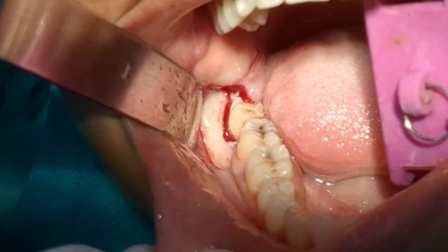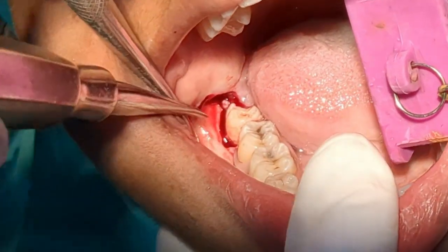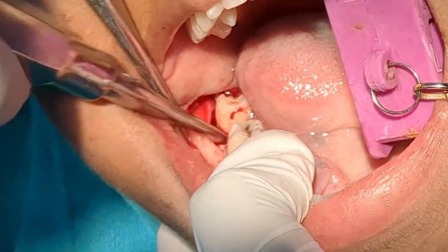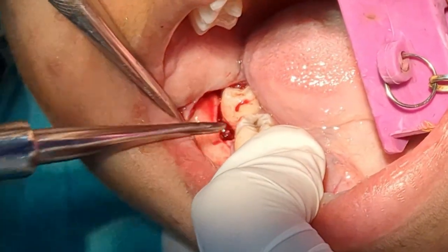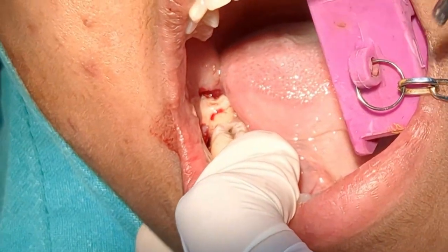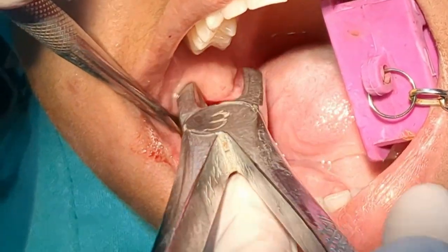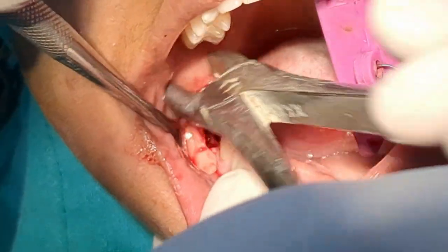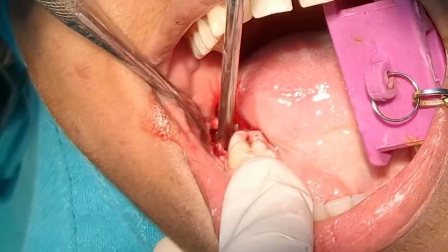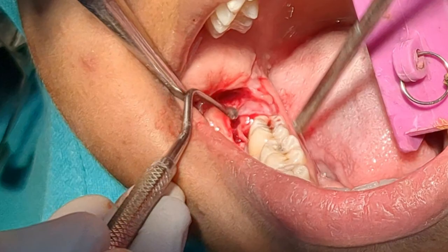This is how the bone gutter looks like. I then place a Coupland elevator in the bone gutter and elevate the tooth out of its socket. I use a mandibular third molar forceps to pick the tooth out of the socket. You can see that the mesial root of the tooth is fractured. The root fractured after elevation, so it is just a matter of picking the root out of the socket with a curette.